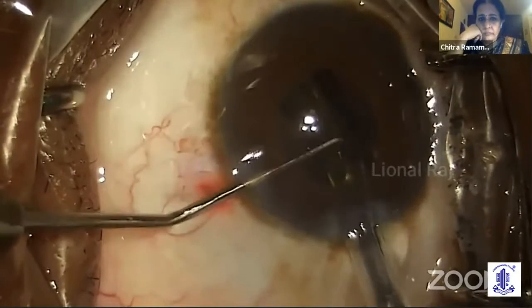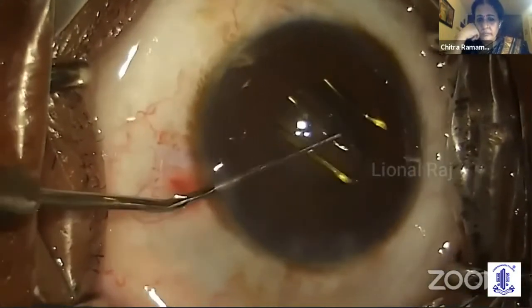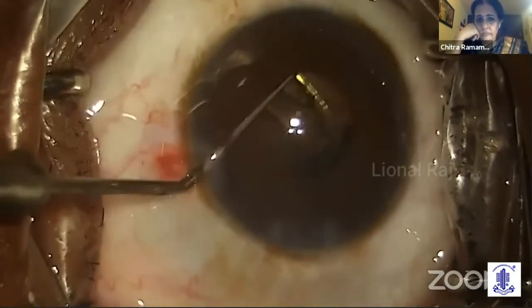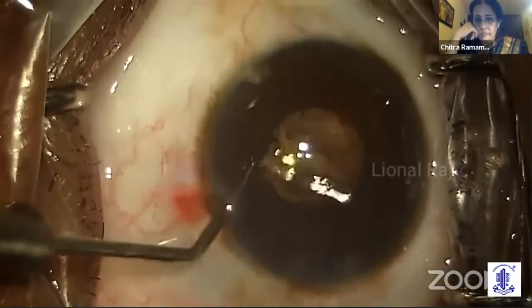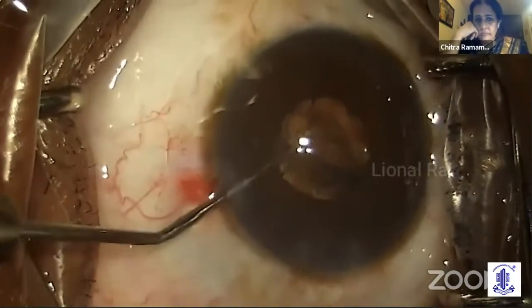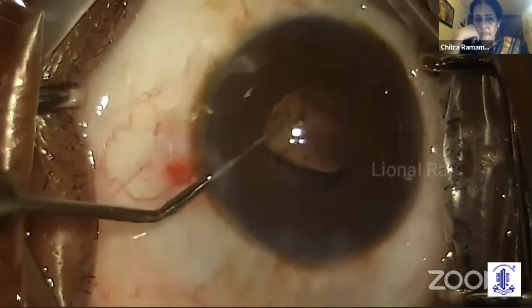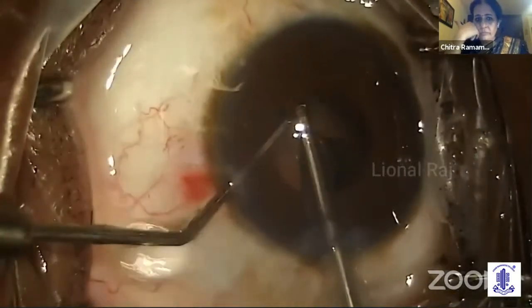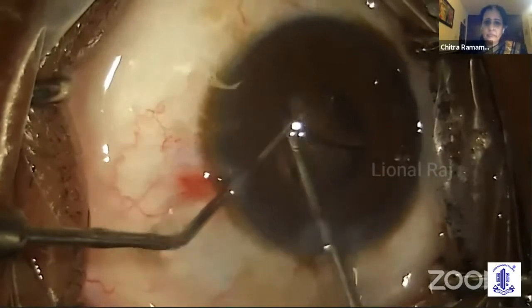After micro-phacoemulsification, a toric trifocal IOL was successfully placed and aligned at 43 degrees — the desired axis. The viscoelastic substances were removed completely from the bag, and the surgeon was happy after successful centration of the lens.